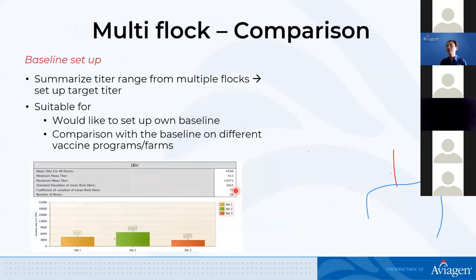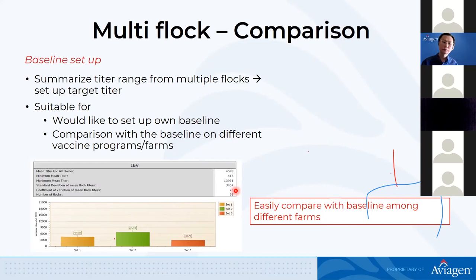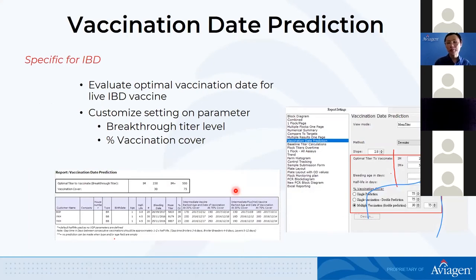Baseline setup is still, I think, not well practiced across the Asia region. I service so many customers. They test the flock periodically or following a so-called schedule, but never utilize it until it is a functioning baseline. So from here, I would like to urge everybody to start working on it. Go back to your big pile of results, get the information out, transfer it into data, and set up the baseline. If you have difficulties in setting up the baseline, contact us or BioChek. Always need to set up and utilize data.